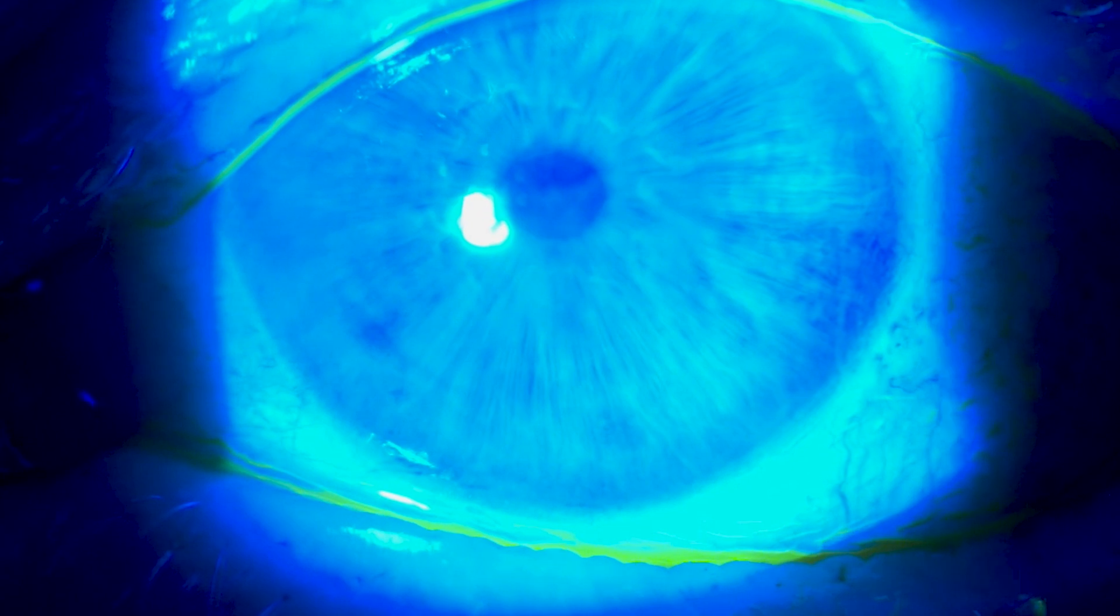When I switch over the cobalt blue filter, it'll highlight cells with that fluorescein on the cornea.